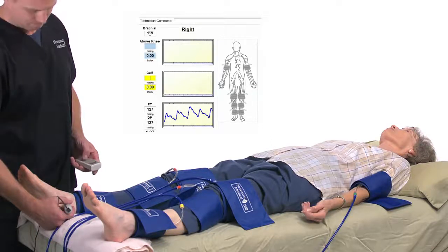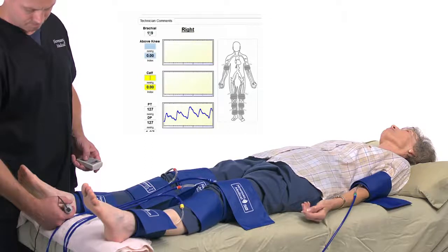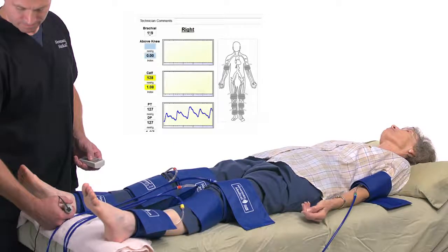The system will move to the calf location. Remember that the pressure depends on the cuff location, not the probe, so keep the probe on the ankle. You can use either the PT or the DP, whichever you found easier to find and maintain. Now use the remote by again pressing and holding Inflate to occlusion and Pressure when the blood flow returns.